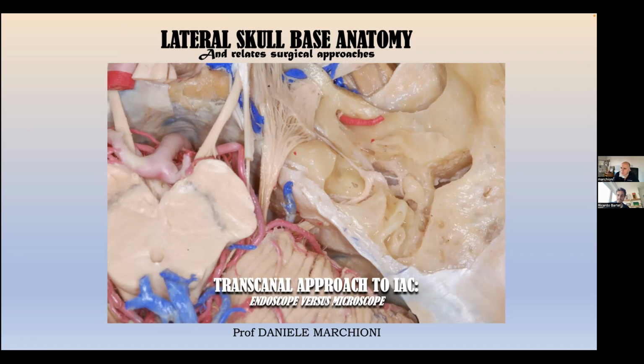So this is possible. It's like the anterior skull base where in the majority of the cases there are two surgeons, one holding the endoscope and the other one performing the dissection. And this is the same with the transcanal endoscopic approach. Of course, with a large approach, you don't need it because you are able to use two hands. So you have no space problem while working with the endoscope and two instruments.